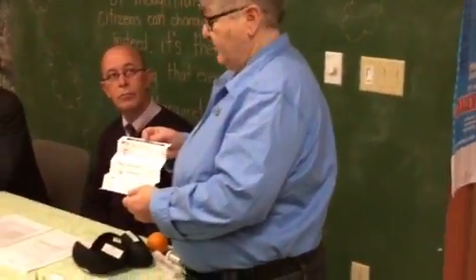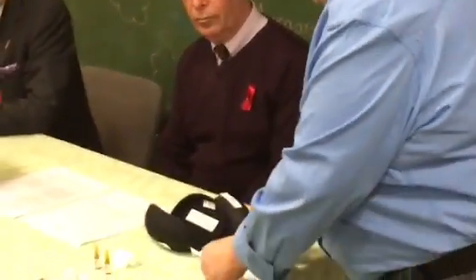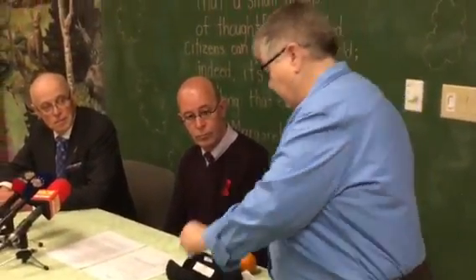Quick and easy set of instructions for the person who's facing the overdose. Very often when the adrenaline sets in, your memory gets all flustered. So it's quick and easy pictures and key notes of what to do first. Each person who receives a kit will be trained in how to use naloxone. And in doing the training, we use the same kind of needles so that they can get used to it.